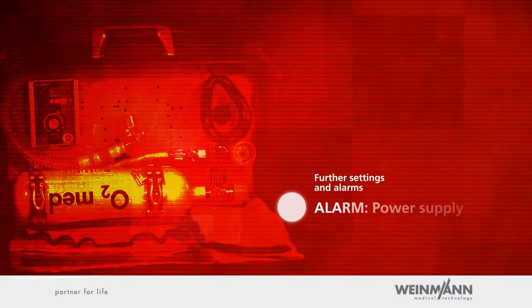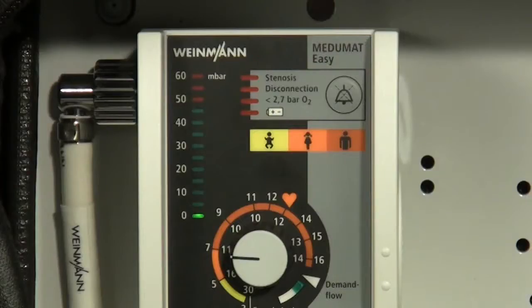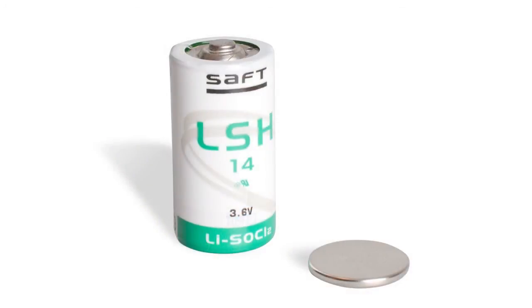Alarm — Power supply. Mejumat Easy is equipped with a main and an auxiliary battery. Given the high capacity of the batteries, no replacement is required between the two-year maintenance cycles when the device is used under normal conditions. Batteries will be replaced with new ones as part of the prescribed two-year maintenance work.